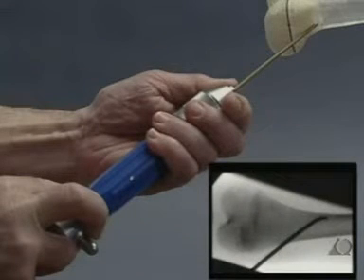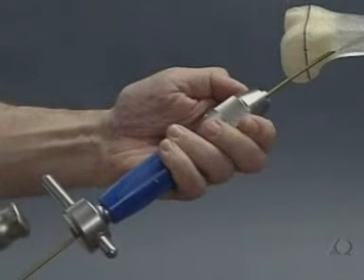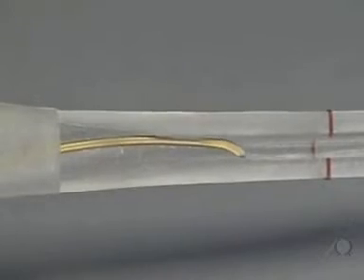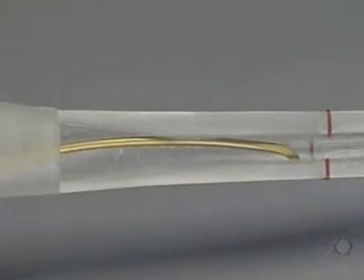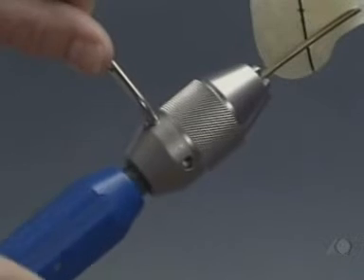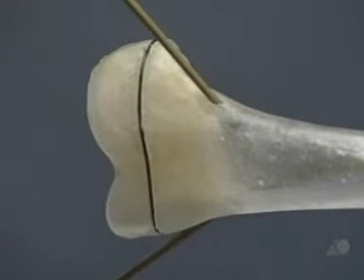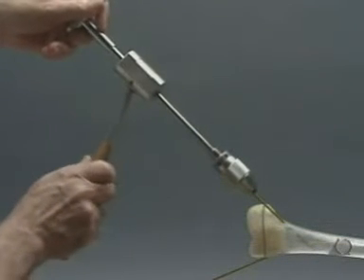If necessary, the position of the nail tip is checked under the image intensifier. The nail is advanced into the medullary cavity manually, either using rotating movements or with gentle taps of the combined hammer against the striking surface of the inserter — the T-piece must not be struck. If necessary, the nail can be further tightened in the inserter with the pin wrench. The nail is advanced as far as the fracture zone, then the inserter is loosened with the pin wrench. At the opposing insertion point, the medullary cavity is opened in the same manner, and a nail of identical diameter pre-bent in the same way is inserted, then advanced to the fracture zone.